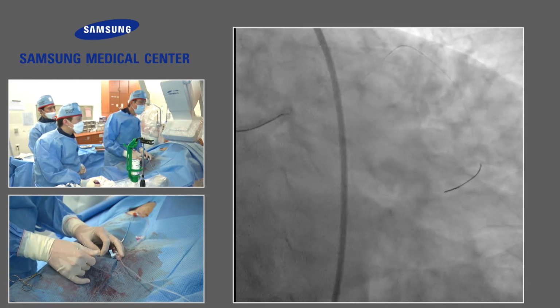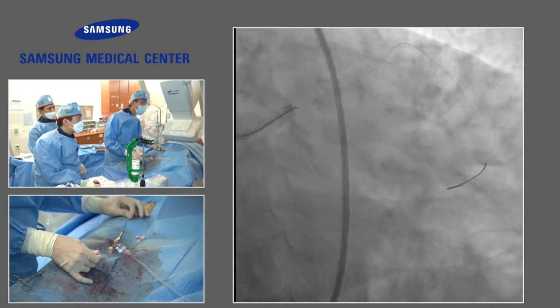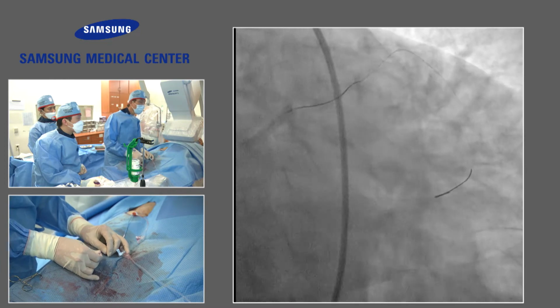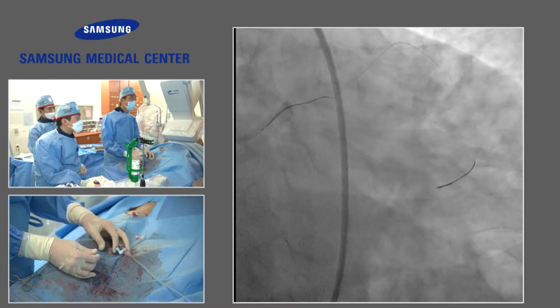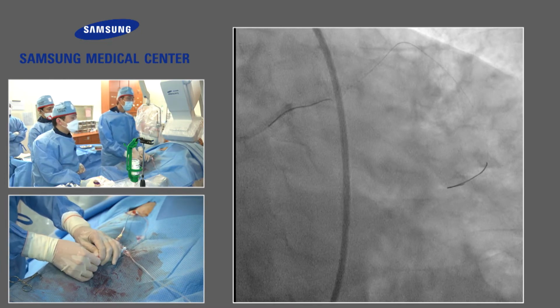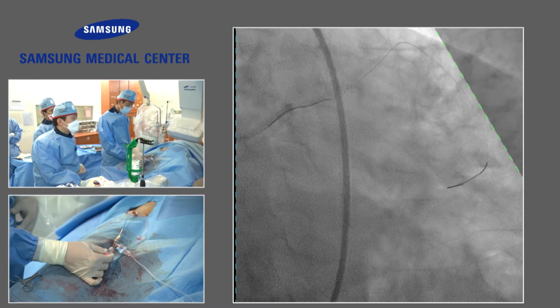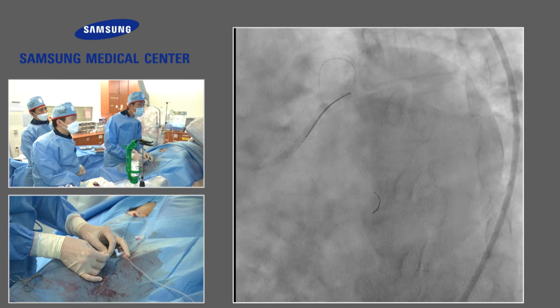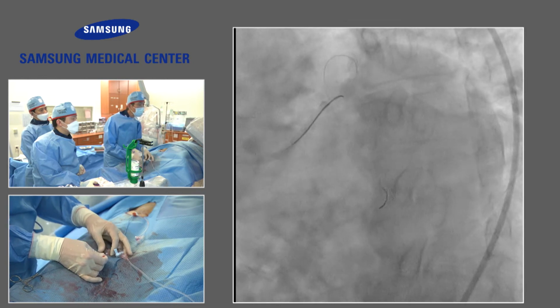There may be some wire prolapse here. Anyway, going to do LAD intervention, the wire comes out, and then on retry, there is total loss of the circumflex. So before that, use another wire.